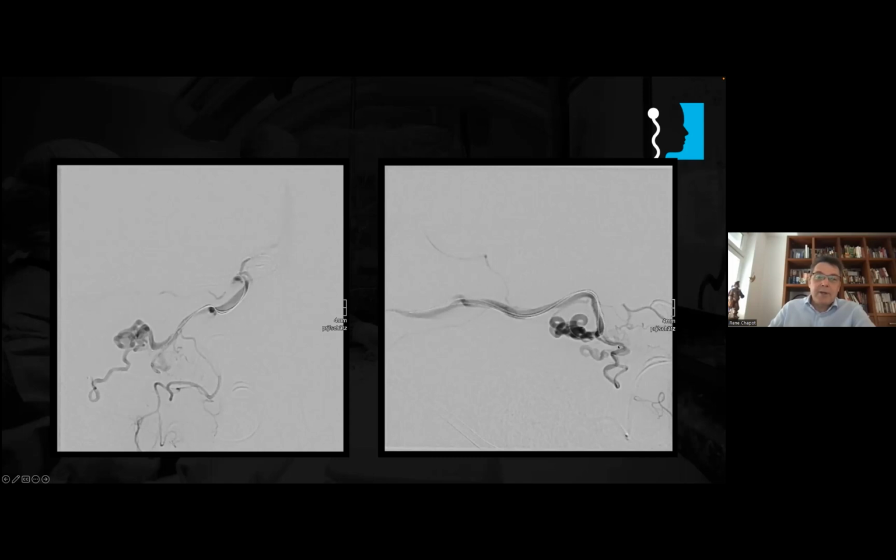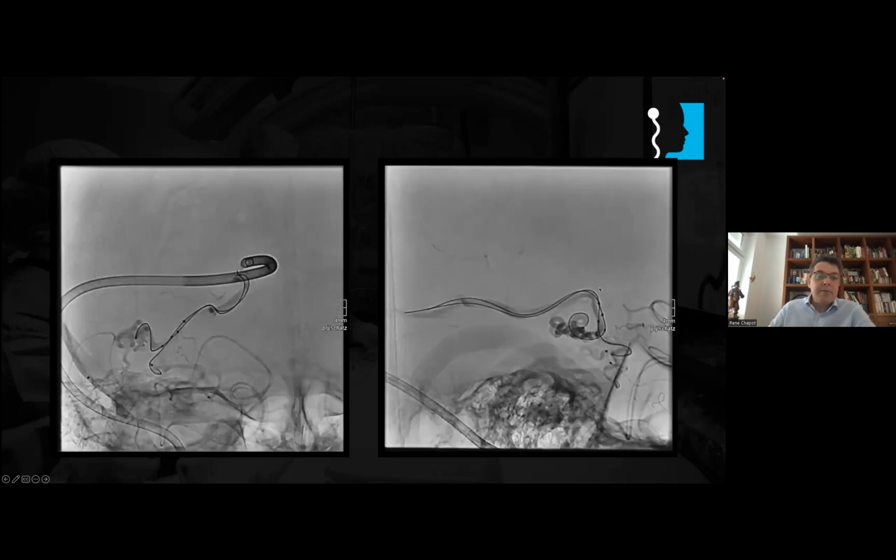And if we understand that this vein is coming from 2 compartments with 2 separate veins, then you can bring one microcatheter here, a second microcatheter here, and a third one to create a plug, what I call the retrograde pressure cooker, to make sure that your embolic agent will go to the AVM and not to the whole normal venous system. So this is what we have here.